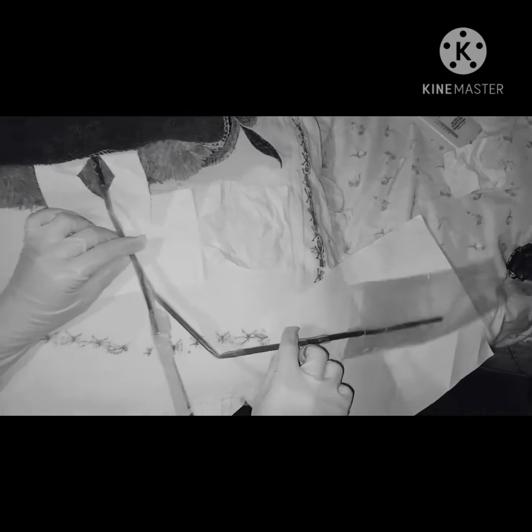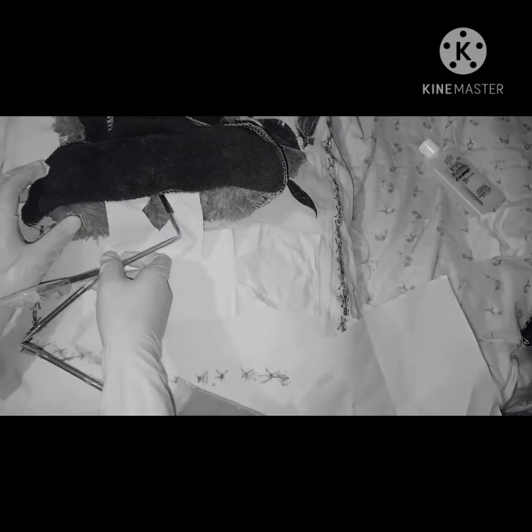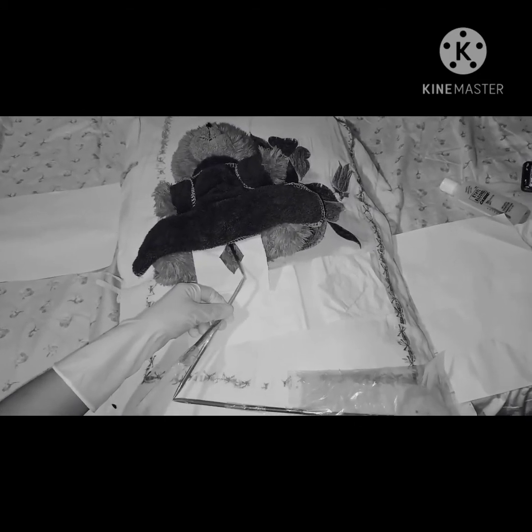After that, I'm going to insert the sterile water into the balloon port. After inserting the sterile water, I must attach the tube to the immovable part. Let's assume that the tube of the urinary catheter is already attached to the immovable plate, and the water is already inserted into the balloon port, and the balloon is already inflated.